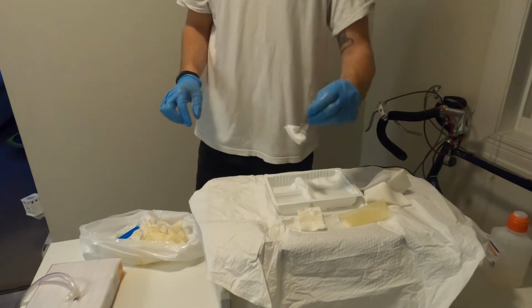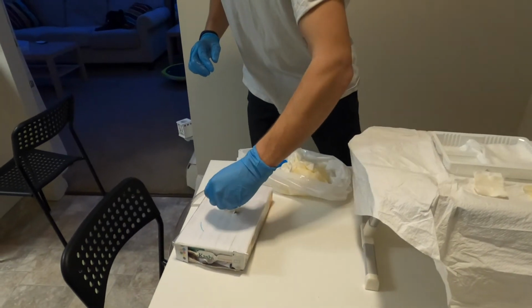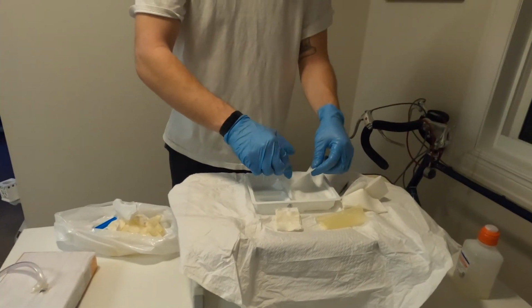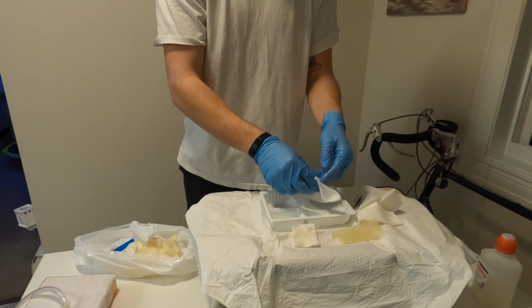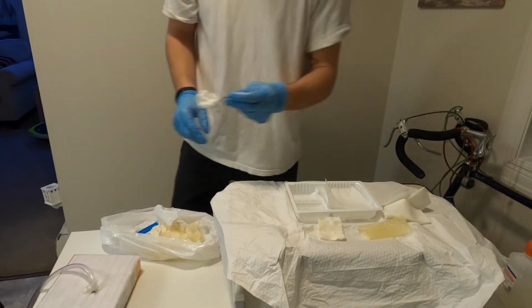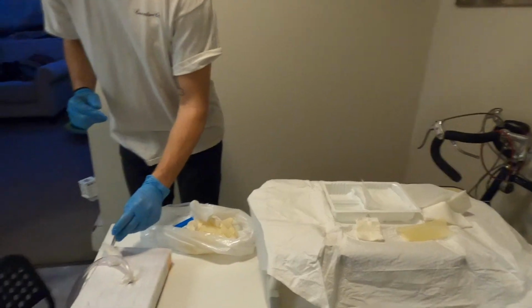Okay, so now I can dry the peri wound. One good swipe. And I'm just going to use my sterile gloves here because I can. We're going to dry underneath here, just like so.